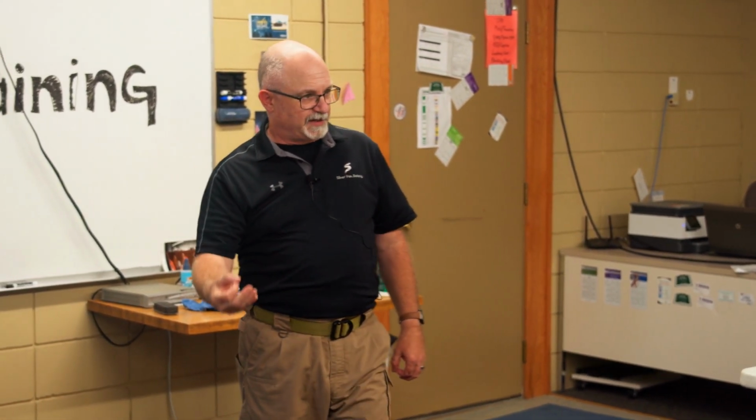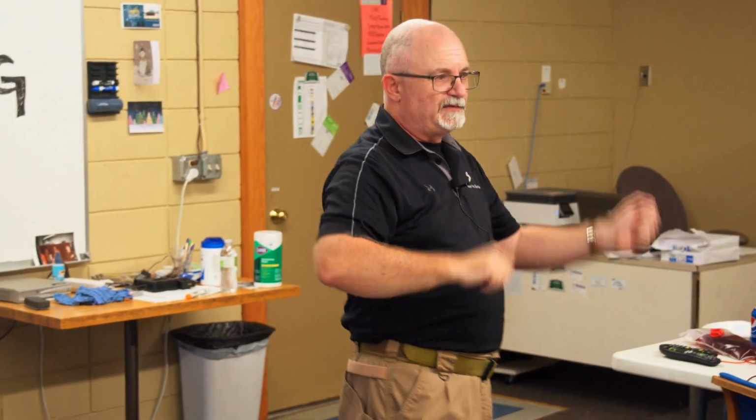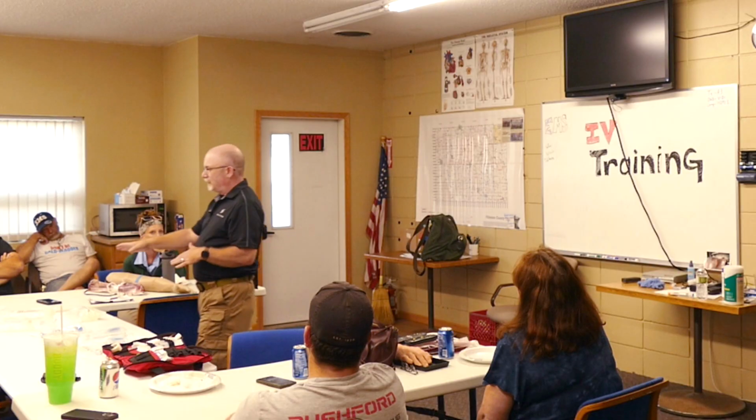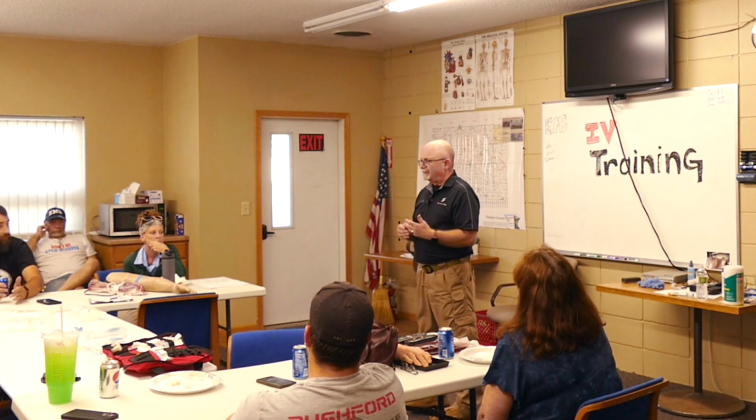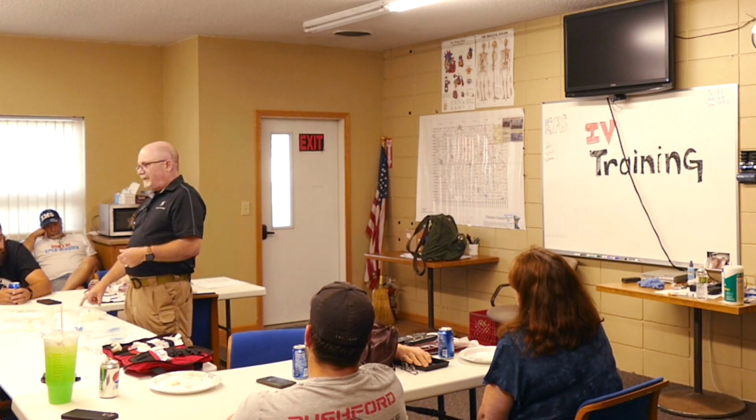Are you cleared for ringers or just saline? He just said saline. Saline's perfect. If for some reason lactated ringers were to get into your supply chain by accident, you're going to do your checks and you go, whoa, that one is also isotonic. It does have a few other electrolytes and some other things in it, but it is essentially in the same class. And not telling you to go against your guidelines, but if that's all you had and you absolutely needed it, it would work as well. But there's a few drug interaction problems with it sometimes, and generally speaking, not a big deal, but it should not happen. But I wanted to cover it a little bit because what's on this label is important. Okay.